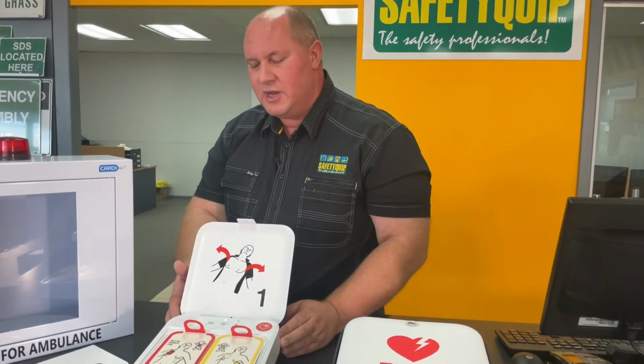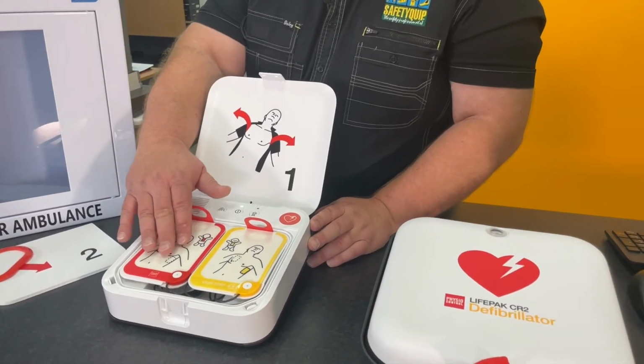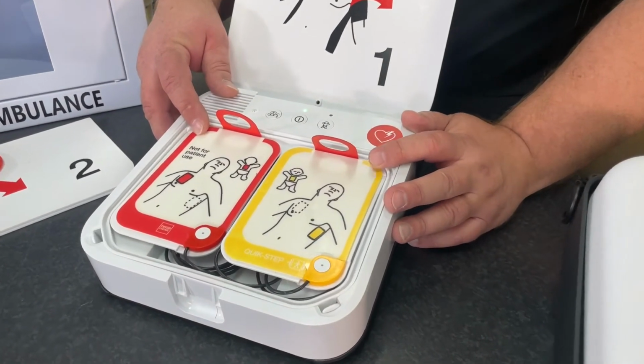That's 4 years. So 4 years change out for both the battery and these pads. They should be changed every 4 years. Now the unit will alert you when that needs to be done.